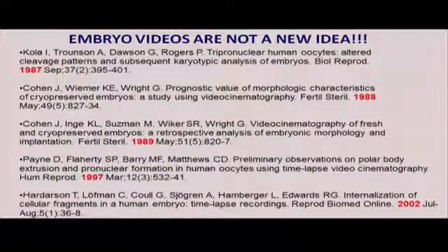Since the early 80s or the late 80s, people have been playing around with systems where they've put cameras on microscopes and tried to video embryos. There's been so many studies. Jacques Cohen, who was a speaker earlier today in the Fertility Planit meeting, had actually developed technologies using videos of embryos. And there have been a lot of papers where people have tried to video embryos to get a lot of information to see which embryo is the one that will give you a pregnancy. So it's not a new idea.